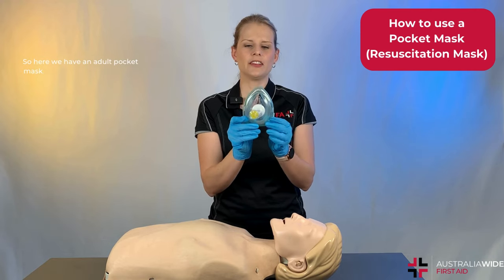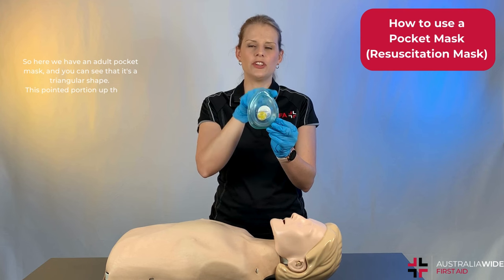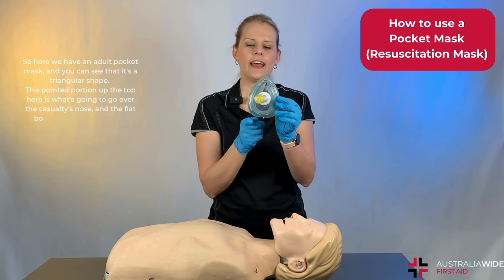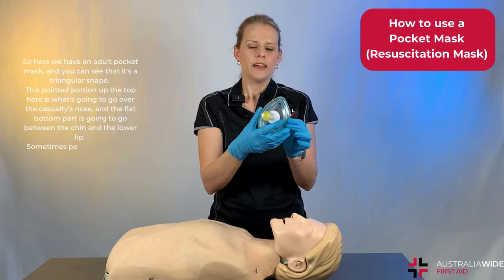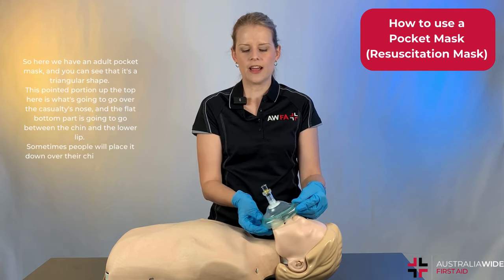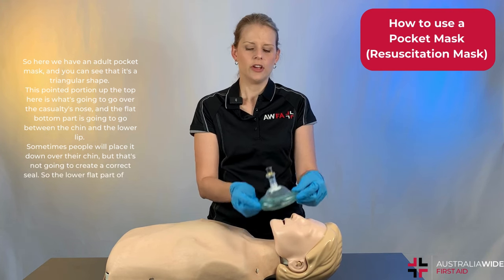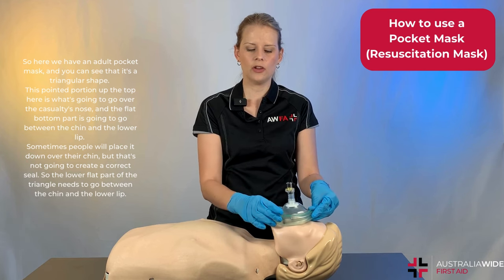Here we have an adult pocket mask and you can see that it's a triangular shape. This pointed portion at the top is what's going to go up over the casualty's nose, and the flat bottom part is going to go between the chin and the lower lip. Sometimes people will place it down over their chin but that's not going to create a correct seal, so the lower flat part of the triangle needs to go between the chin and the lower lip.